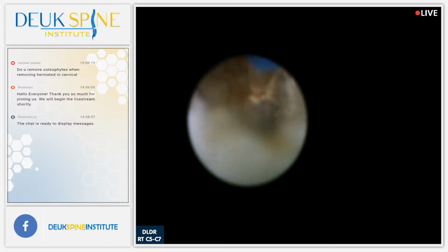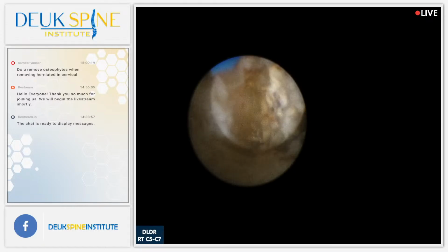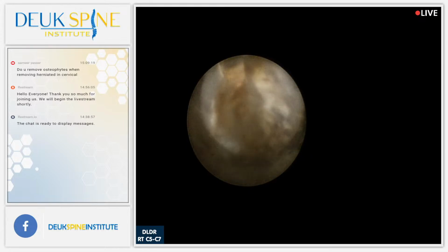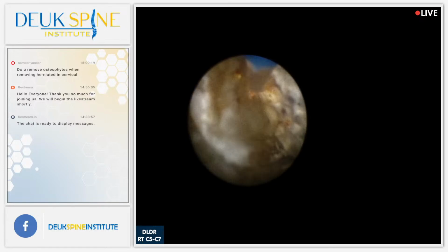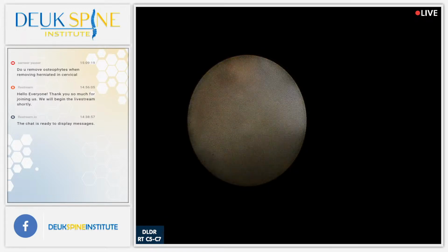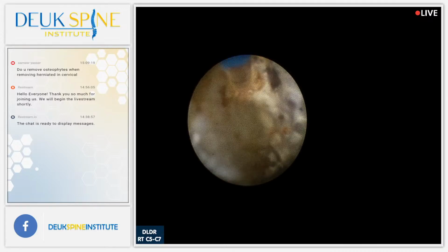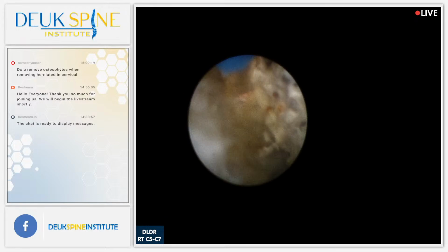Yeah, we've removed osteophytes in many spines with a laser. But the amount of osteophytes we see typically is not this much. This is really, really bad. Probably related to his football injuries over the years to his neck, if I had to guess.